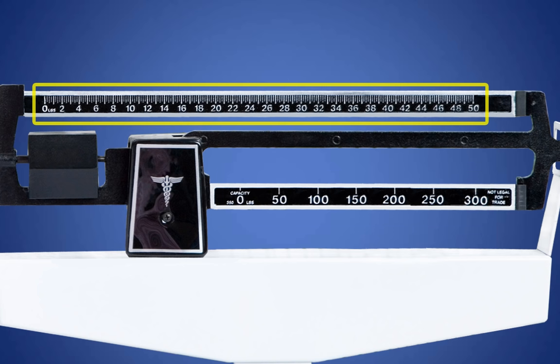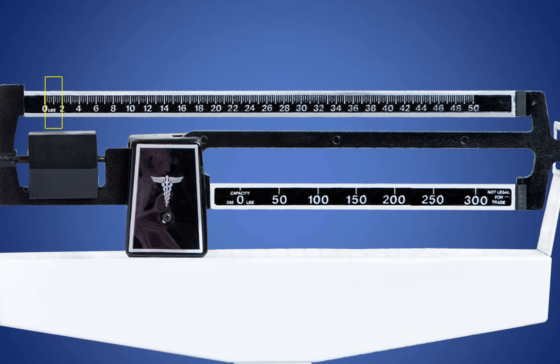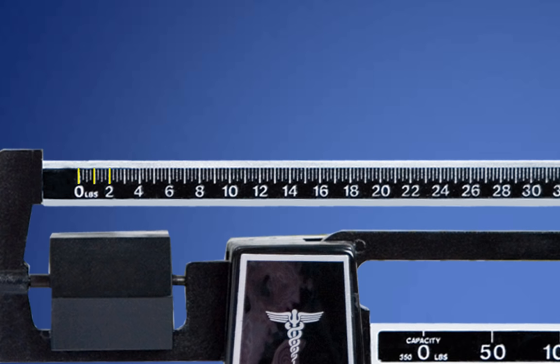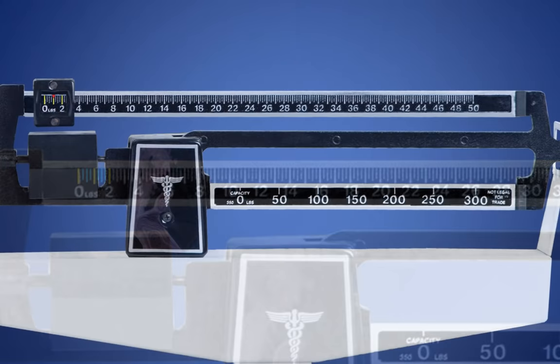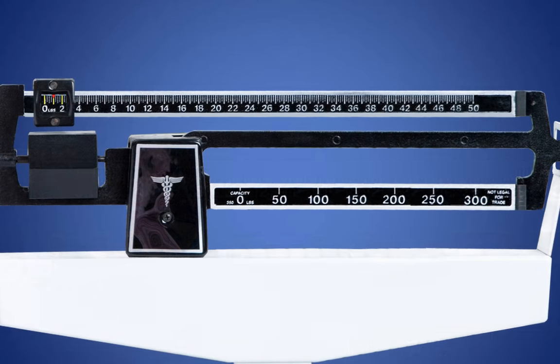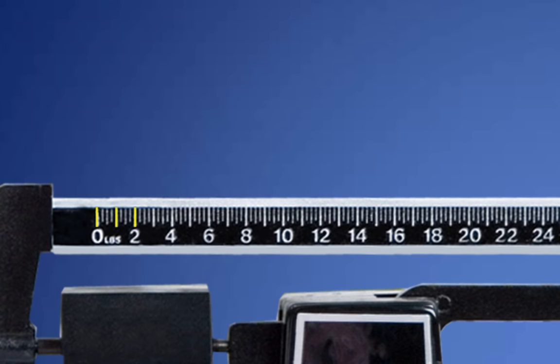The upper bar numbers increase in increments of 2 pounds. However, there are more calibration markings in between each number that must be interpreted correctly. Let's first focus on the sizes of the lines. You have long bold lines and thinner medium and short lines. The long bold lines are whole numbers. This line indicates 0 pounds. This line indicates 1 pound. And this line indicates 2 pounds.